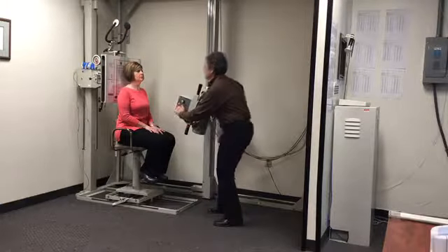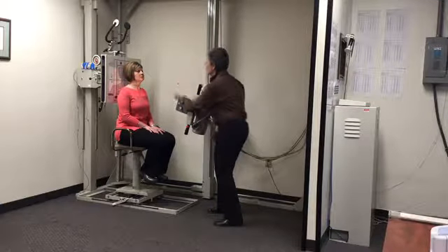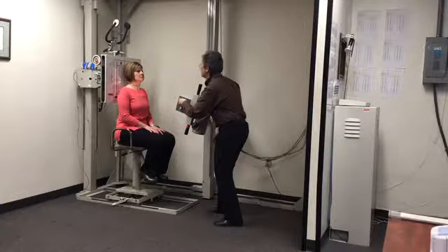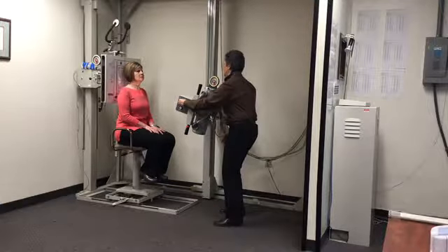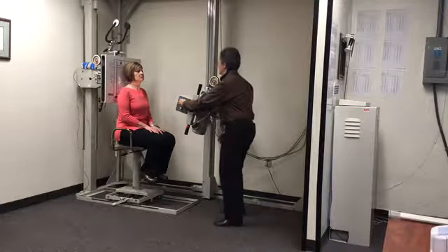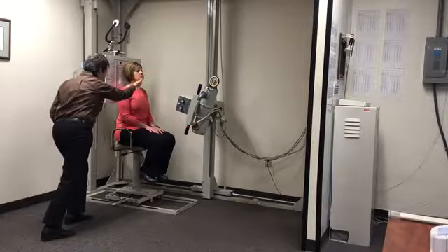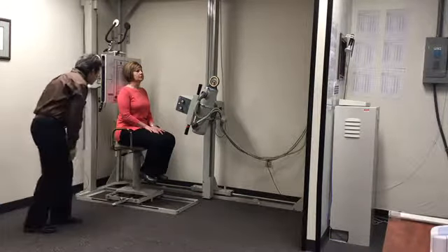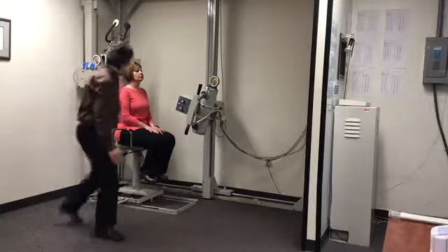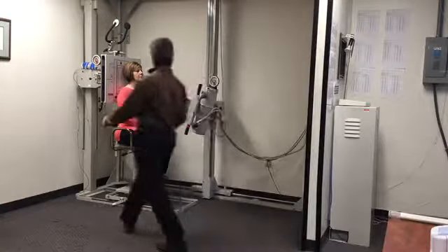So I'm going to step over and I'm going to get my collimation, 1/2 inch medial to the pinstripe for the 10 by 12 cassette field. So top and bottom shutters first, now my side shutters, 1/2 inch medial to my 10 by 12 pinstripe. And I'm going to check my patient's posturing. We're going to give instructions to the patient to take a deep breath, let it all the way out, watch the patient, let it out, hold it out, keep the chin up, don't move, breathe. Make the exposure, come out and relax your patient.